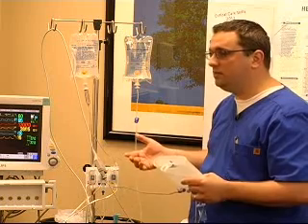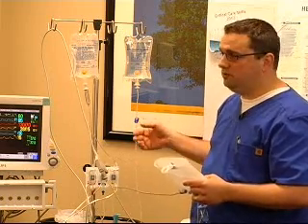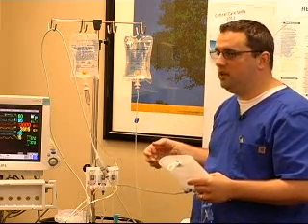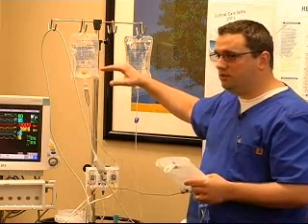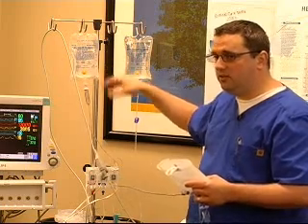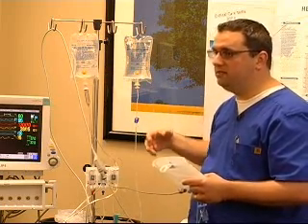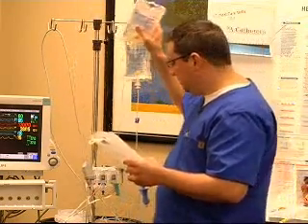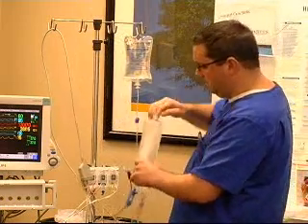So it's not a bad practice when you come in, part of your assessment of your patient and your equipment, to make sure that it's been replaced in the last couple hours or that you just probably go ahead and replace it. Because like we were saying before, when your bag volume drops to 200, 250 or less, you start to get inaccuracy, and it doesn't maintain good pressure, and you don't get that full effect of the 3 cc's like it's supposed to be to keep your line patent. Okay, so label your bag and put it in your pressure bag.